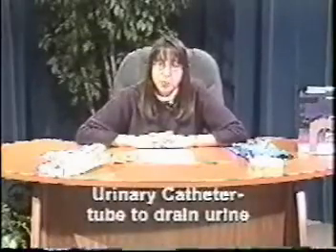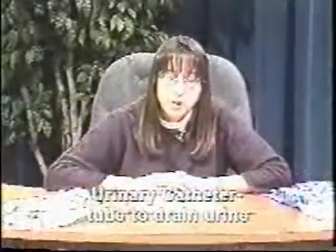In today's session, we will discuss the care of the patient with a urinary catheter. A urinary catheter is a tube that is inserted through the urethra and into the bladder to drain urine. The urinary catheter is inserted temporarily into the bladder to relieve the pressure from a full bladder of urine. The full bladder may be caused by a medical condition that does not allow the urine to flow out freely from the bladder. The inability to empty the bladder is called urine retention.